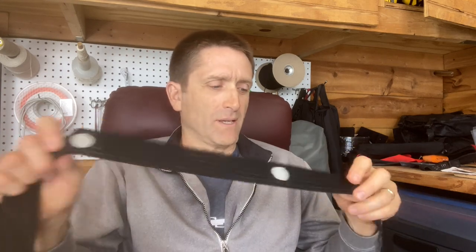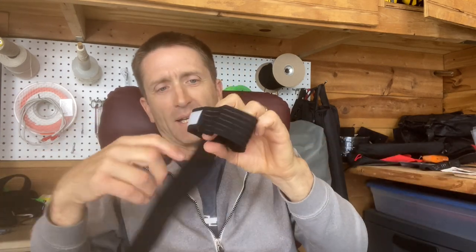The tabs for this one were circular. Some people didn't like how that grabbed. And on this end had a metal slip clip, which really didn't work great. It was okay, but not great. So anyway, back to the drawing board, and that is what led to the current version. I should also say this, the length of it was pretty similar to what we have now, and the width as well. And I'll go into the decision for the width and then the length.